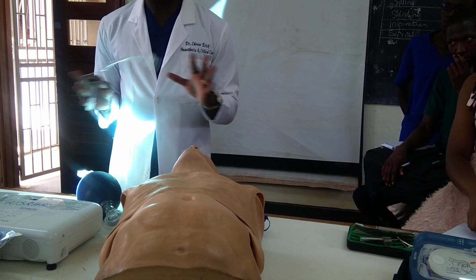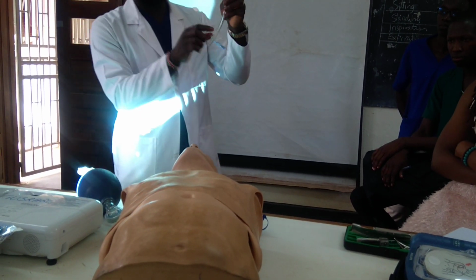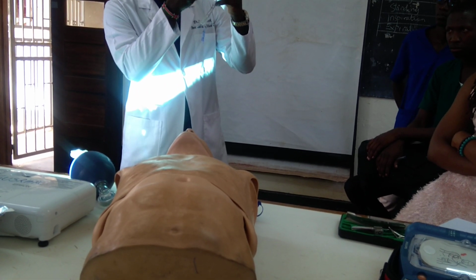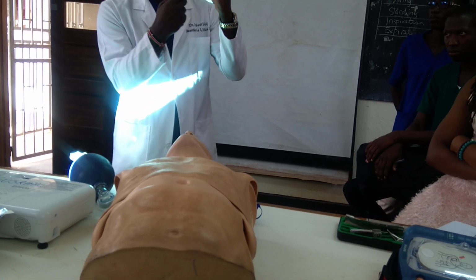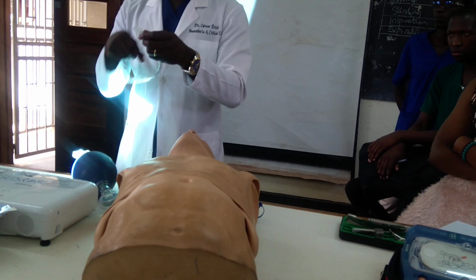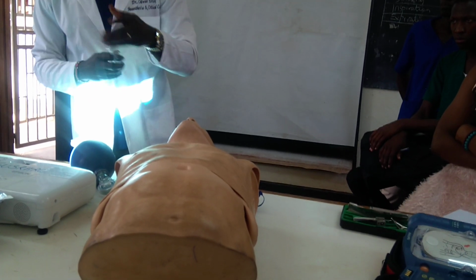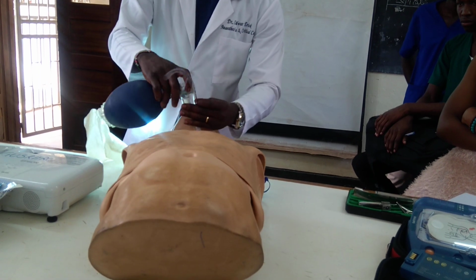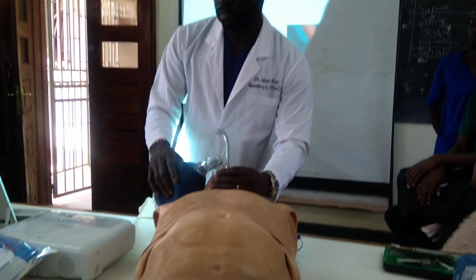In settings where we are desperate, we can cut this nicely through the tubing because it's used for ballooning this cuff. You cut it in that line nicely and leave it, and then cut across there. You don't cut across all through. Leave the line at that point, cut it, and then disconnect this part, connect it there. This is a universal connector. You can get off. Then you connect it here, and from that point it connects here and you ventilate the patient through here nicely. Okay. Because we already have a hole there.